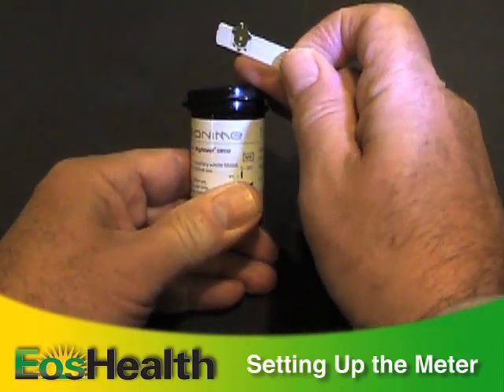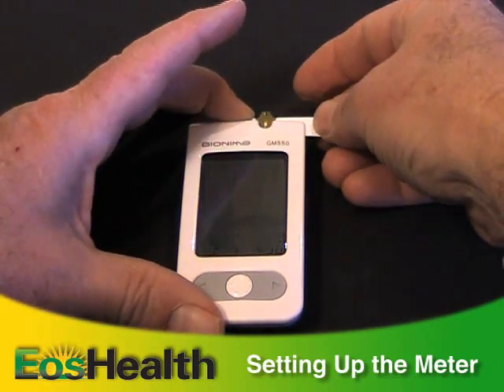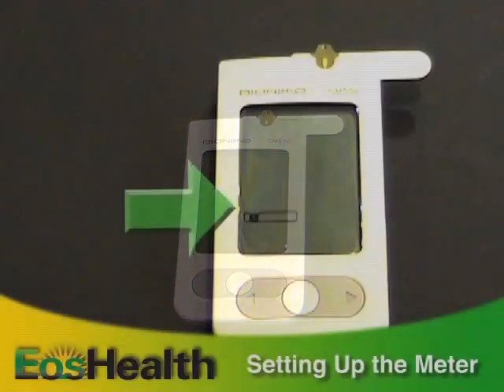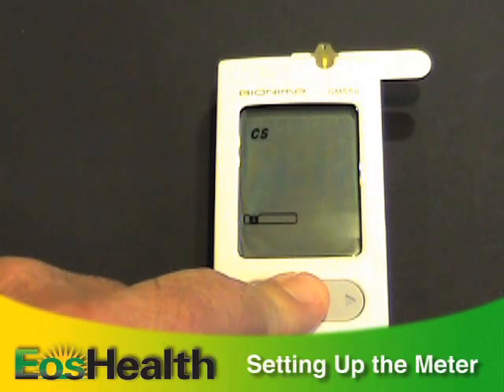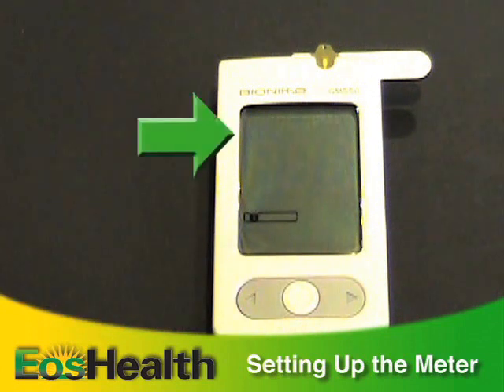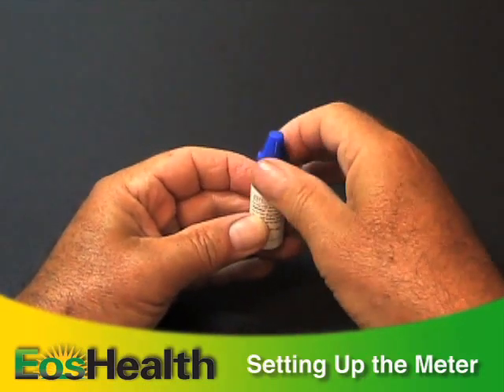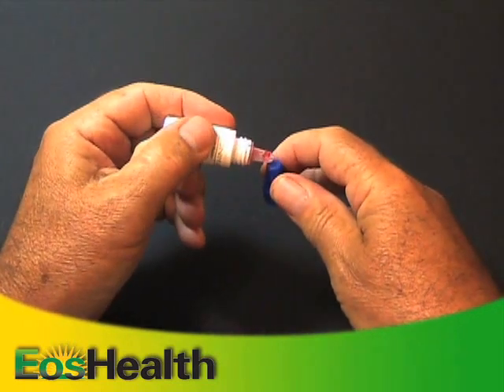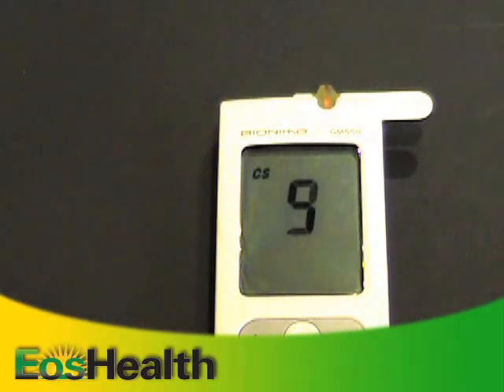Take a test strip from the vial and recap the vial immediately. Insert the strip into the port on the top of the meter. While the blood drop symbol is flashing, press and hold the main button for over three seconds. You'll see the letters CS blinking on the screen, indicating you're in the control solution mode. Shake the bottle of control solution and apply a drop to the top of the cap, then touch that drop to the strip. You'll hear a beep and see a countdown on the screen.